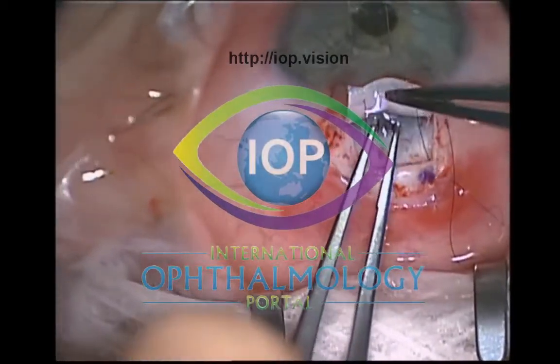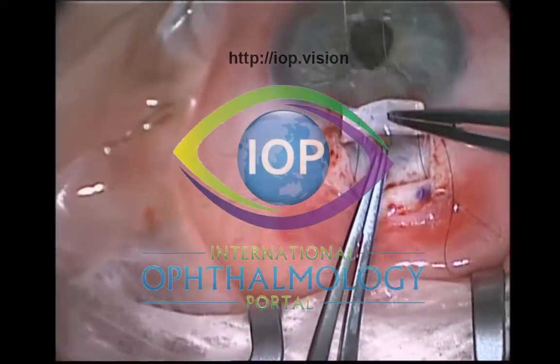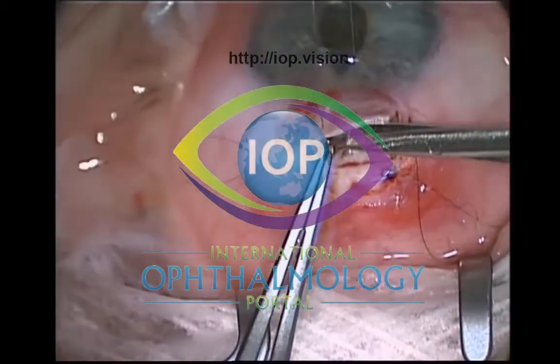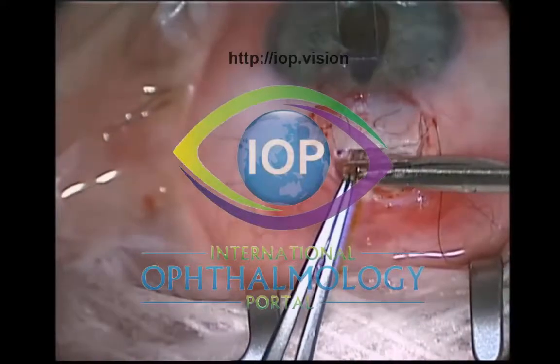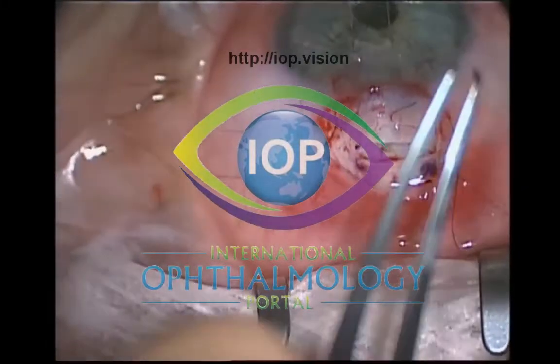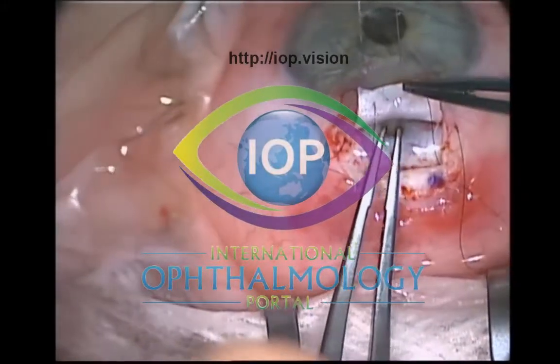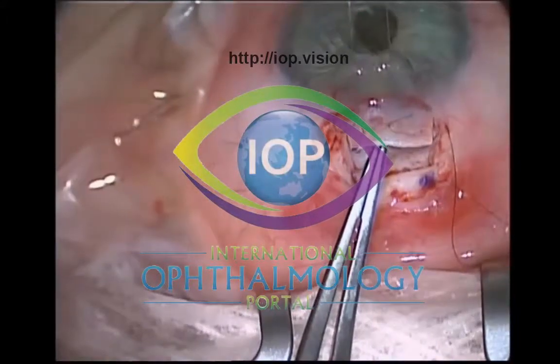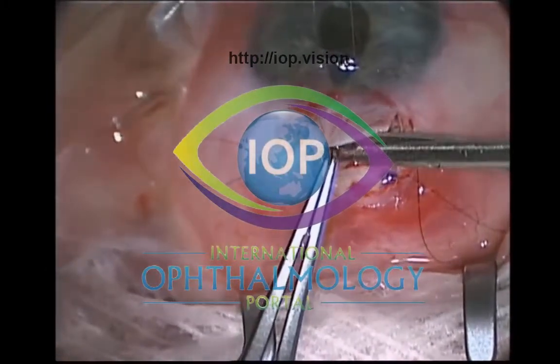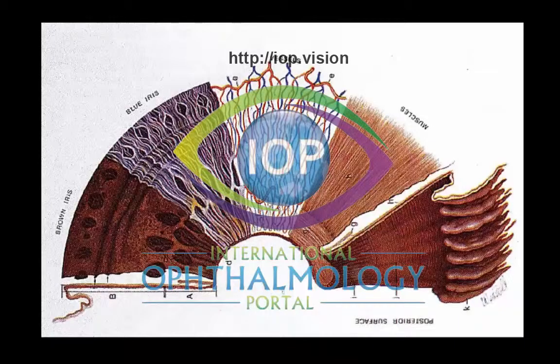If you cut mid-peripheral iris, you end up with too large an iridectomy, which could potentially cause visual problems if the iridectomy extends beyond the lid margin. There are different ways to cut the iridectomy. I like to, once I've grasped the peripheral iris tissue, use Vannas scissors to cut tangentially — tangential to the limbus — and that way you end up with a broader-based iridectomy. If you cut radially, you end up with a smaller base iridectomy that could potentially encroach past the superior lid margin.